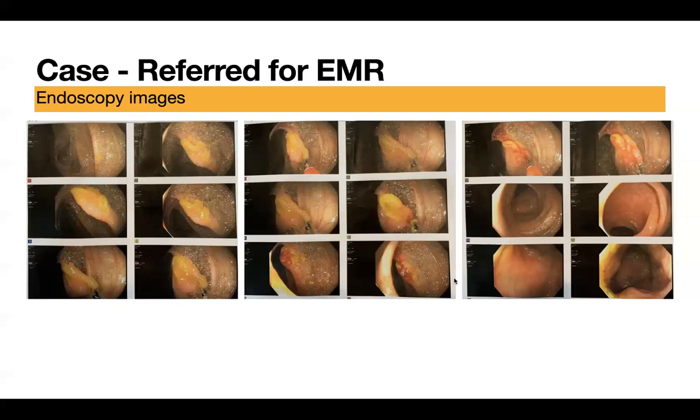Right. A couple of things I would like to comment on for the sake of fellows. One thing is you want to get into the habit of clearing off all the bubbles before you take pictures. By doing that, you are showing that you are taking precautions, because you can miss polyps that are hiding beneath those bubbles. So it is a good habit.